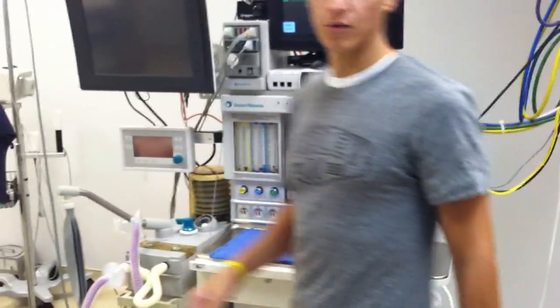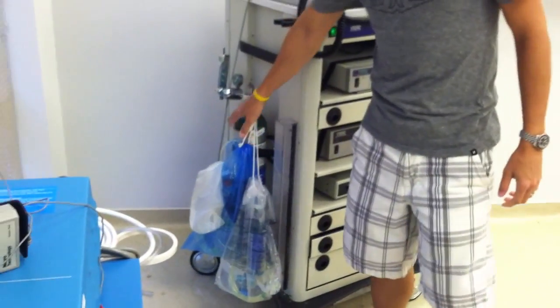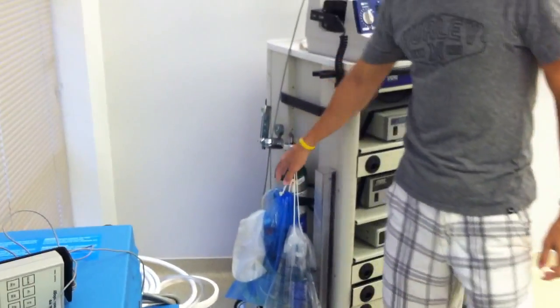Alright guys, we're going to do the machine checkout now for the Aestiva. The first thing you want to do with any machine checkout is check your backup oxygen tank. Make sure that it has enough PSI — at least 1000 PSI. You'll find those at the hospital outside of the room.